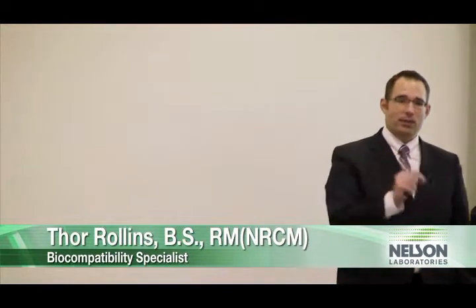Because the human blood chemistry changes so much from day to day. Okay? It matters what you ate, it matters what you exercise. If you ate that carrot cake right now, tomorrow your blood, it's not going to be too nice. So the blood changes so much that even if you take your same device and test it from day to day, your results could be different. Okay? So what does that mean for pass-fail? The only way we know is to compare it to a device that's already on the market. Okay? So we use a predicate device.